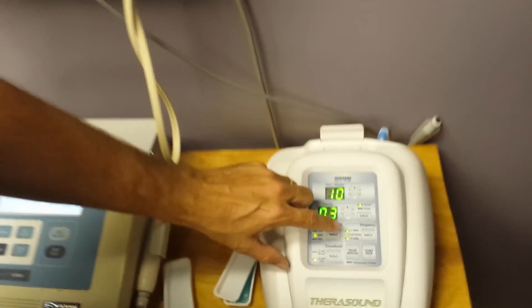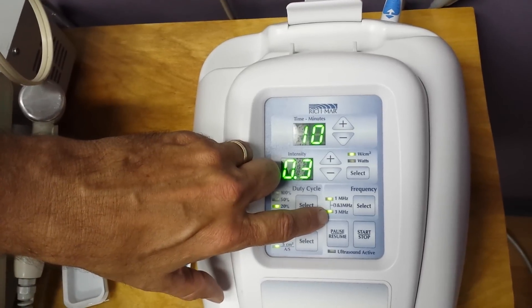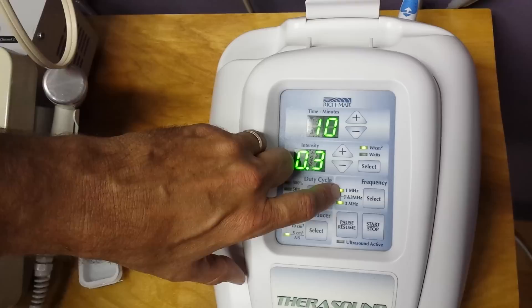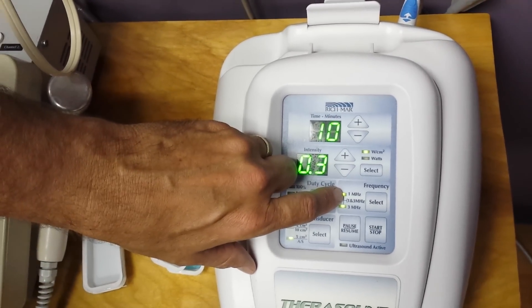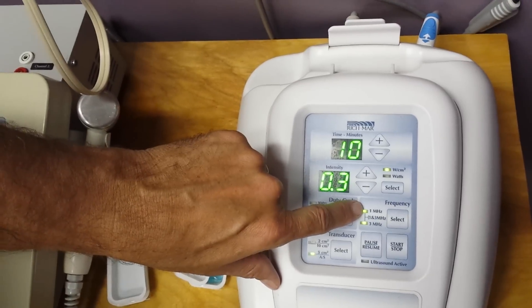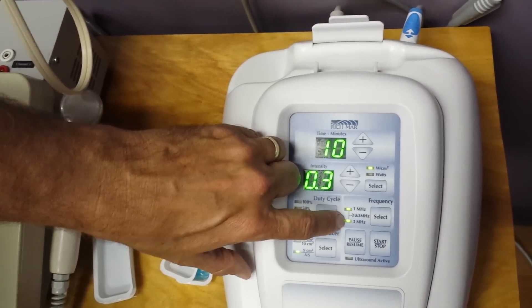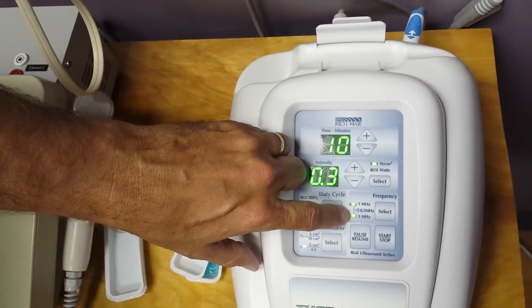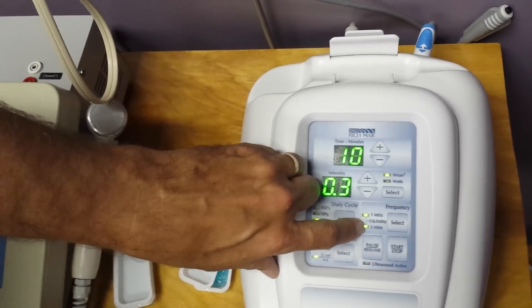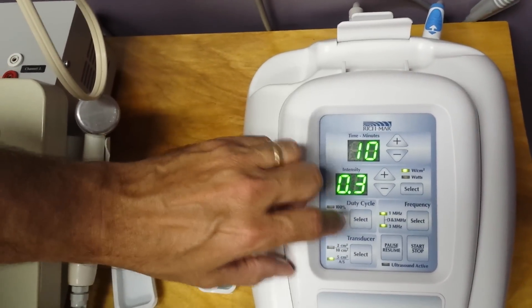The first thing we want to decide when treating a patient is what frequency to use. We have the choice of 1MHz and 3MHz. 1MHz is more commonly used. It typically travels about an inch and a half down into muscle and about 6 inches down into fat. 3MHz will typically penetrate about a third the distance of 1MHz. Practically, most treatments use 1MHz. If you have a thin area like a collateral ligament of the knee or a wrist, you'd switch to 3MHz.